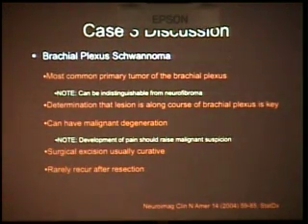If you follow the nerve root out, it became fusiform enlargement and then went back to normal size. Problem is these can be indistinguishable from people with neurofibromatosis, neurofibromas, but it is the most common primary tumor of the brachial plexus. And then again, you just want to tell your clinicians where it is. These lesions can get malignant degeneration. If they start to have pain, that's a worrisome sign. And typically, if you take it out, they're cured, and they rarely recur. About halfway through the cases now.